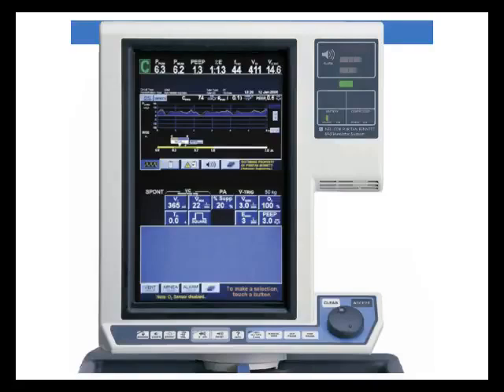Let's say your ventilator doesn't have waveforms. It's one of, let's say, the old bird vents that doesn't have that. Can you figure out if they're still having these AutoPEEP problems?